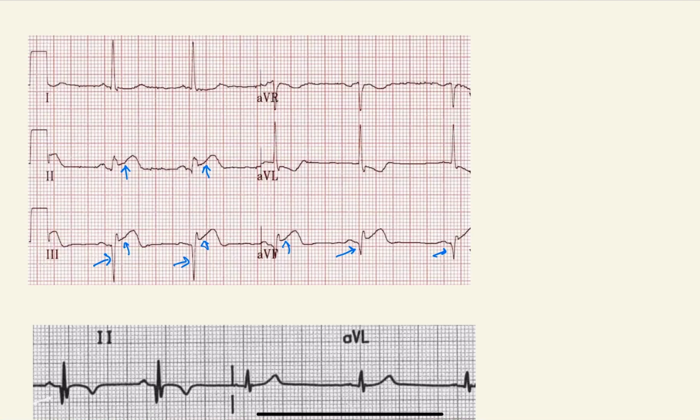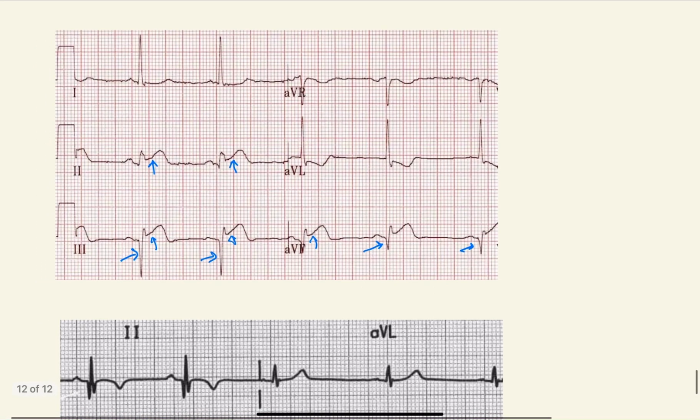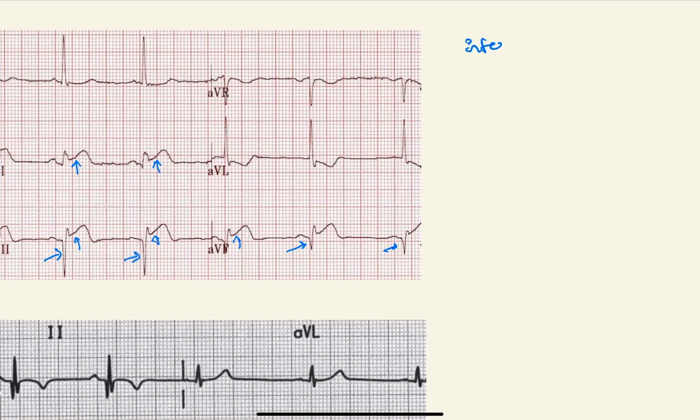So this is inferior MI with Q waves, that is acute inferior wall MI.